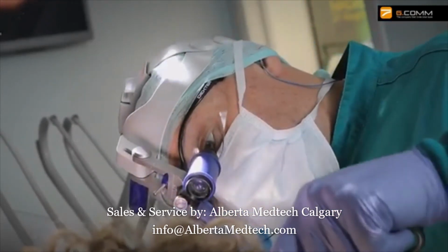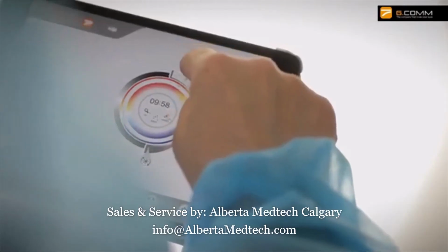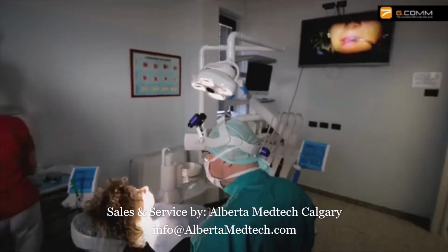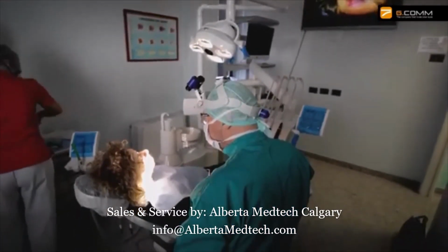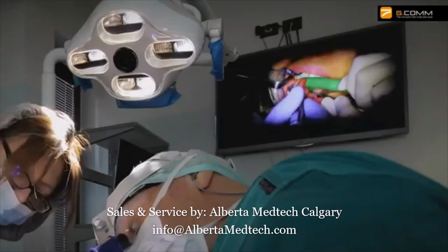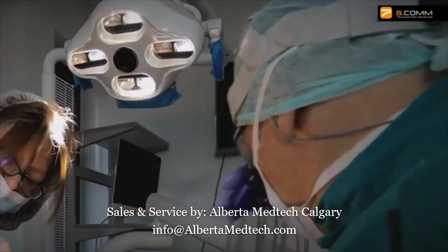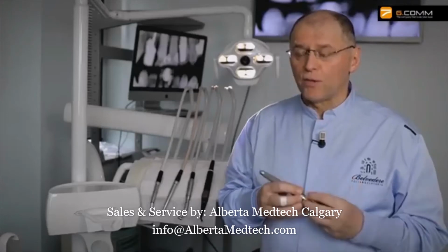How? In the same way we use our mobile phones. In other words, with the Wi-Fi, the possibility of modulating and controlling the video camera during filming via a remote system, and at the same time being sure the positioning is correct. This is because if the illumination of the operating area by a lamp that is clearly illuminated with LEDs is correct, our filming will also be correct.